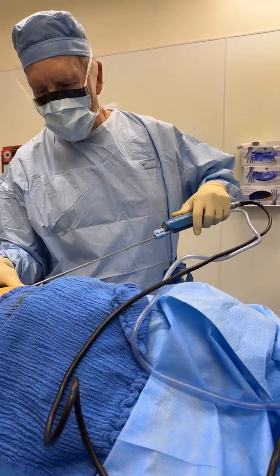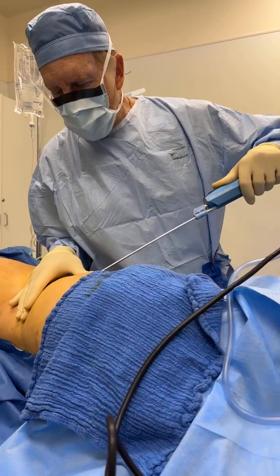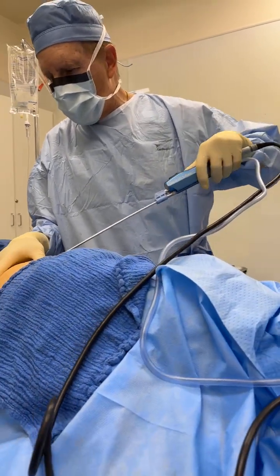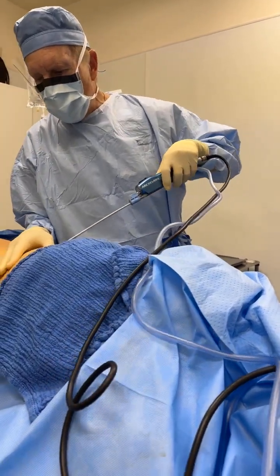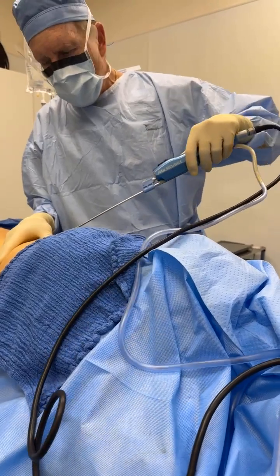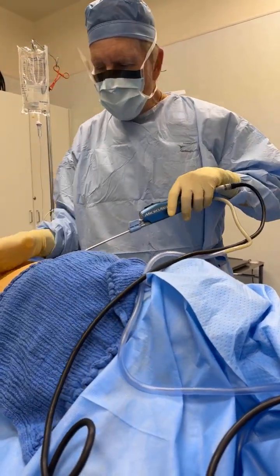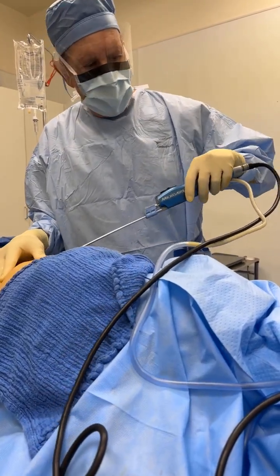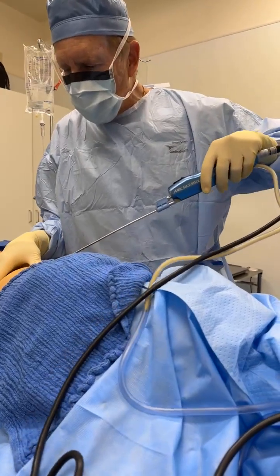Power-assisted liposuction — we're going to do liposuction to this area, and I predicted this is going to be bloodless. You'll see what it is, but it's always bloodless. This is something predictable. I'm actually going to be teaching how to do this procedure in a bloodless manner. Notice how I'm ambidextrous — this is my non-dominant hand, so I can do this with my left hand because I'm right-handed.